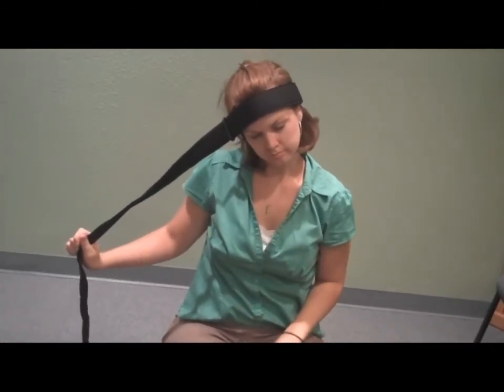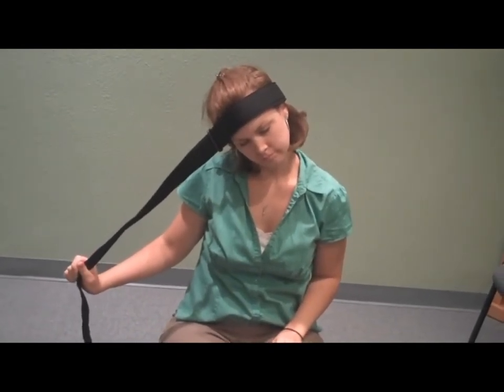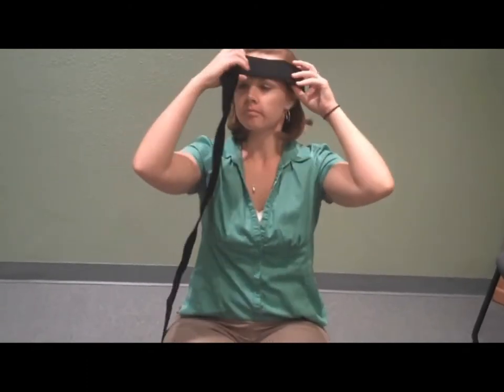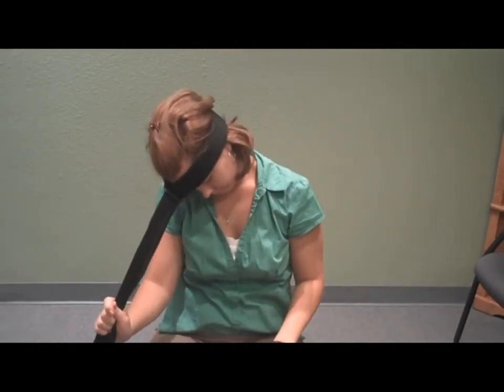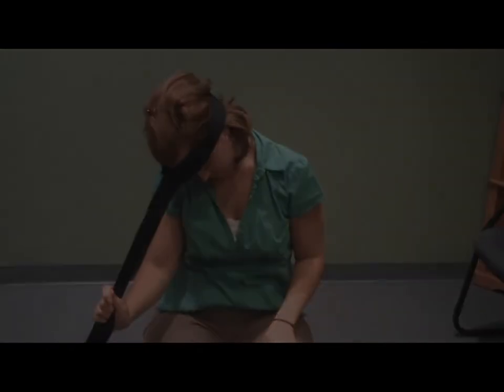It's important to keep the correct erect posture so that all the stretch takes place in the neck. She'll hold it for 40 seconds, then simply rotate it to above the other eye, keeping going in that circle, pulling down again and holding for 40 seconds — and once she's done with that, she will be complete.